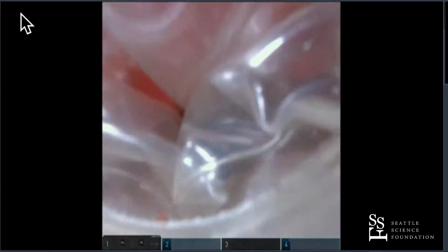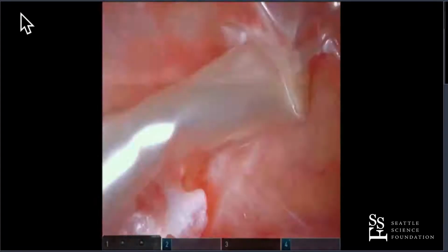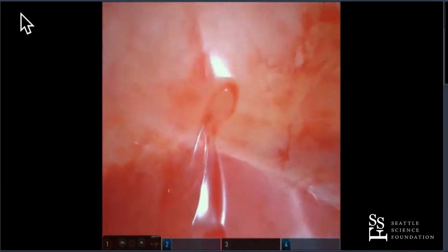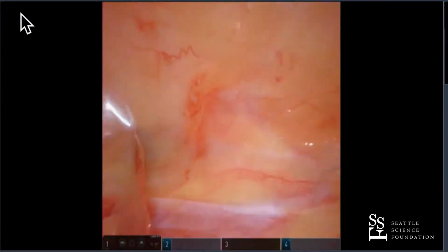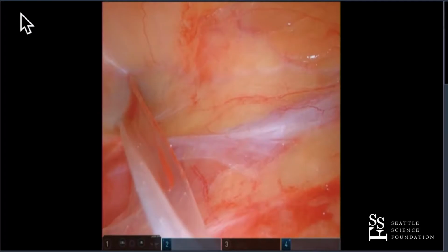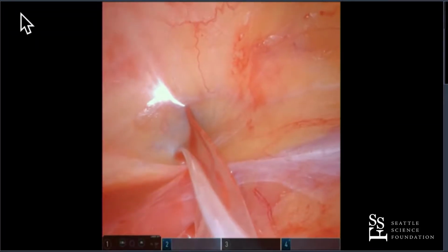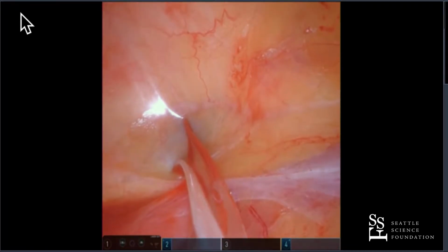So here's the balloon. We're inside. We've got a 30 down lens right now. Go ahead. So the first thing you see is the psoas. There's psoas, and you can see the folds kind of coming out of it. But now, hold on a second, Brando. This white line here you see coming off the psoas, that's the posterior Gerota's fascia. That's actually being pushed off the psoas muscle. So this is an important landmark because this is the space we're going to enter to get into the kidney.